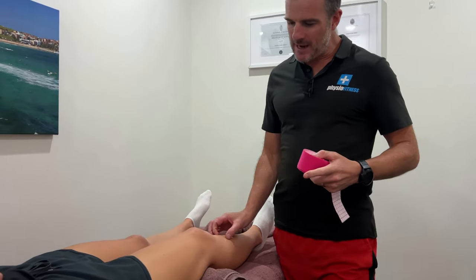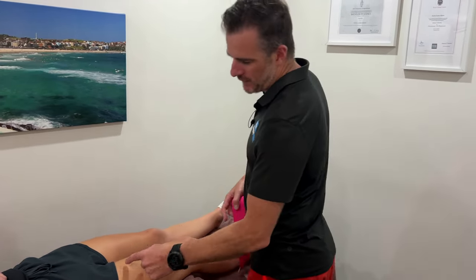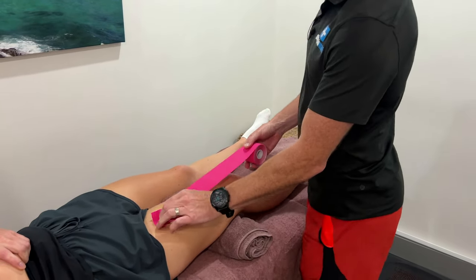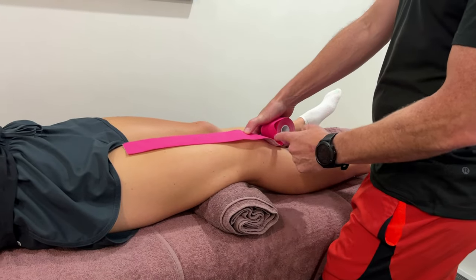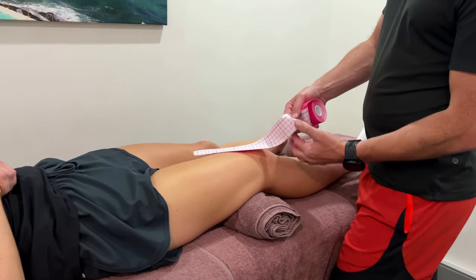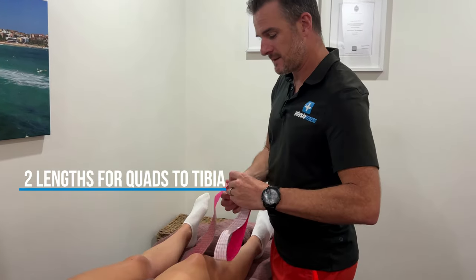First we're going to do a double layer for just about the entire quadriceps. We're going to use the rectus femoris at the top as the muscle because it goes straight down the middle — it's the easiest one to use as a tape anchor. Think of going right up that quad with a long anchor at the top and a short anchor down at the bottom. Don't measure all the way down and think that's how long it needs to be — you're going to stretch this tape. Come back to about the top of the kneecap, because with a 75% stretch it'll lengthen out. Count about six and a half squares, then cut two of those — just double it.